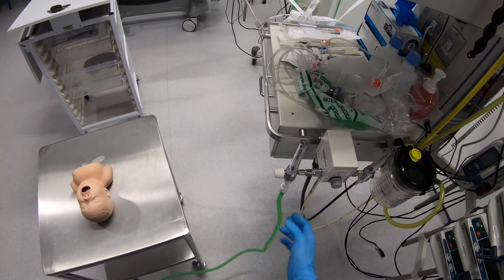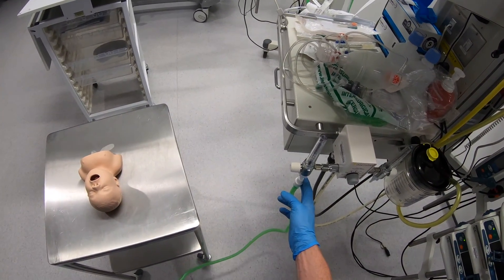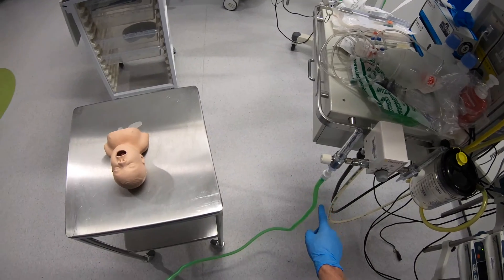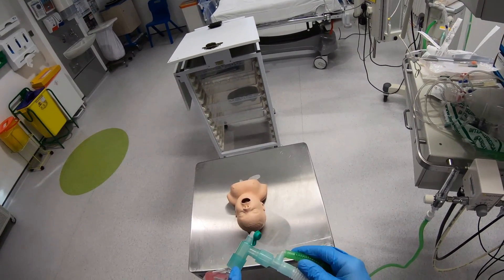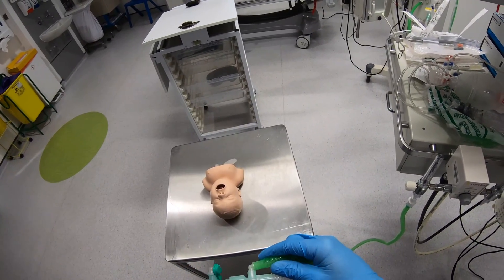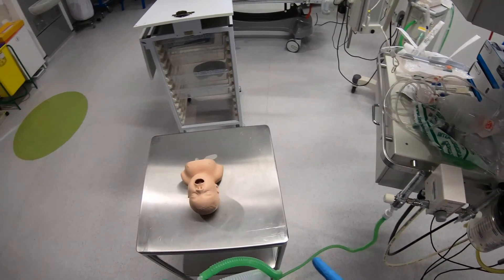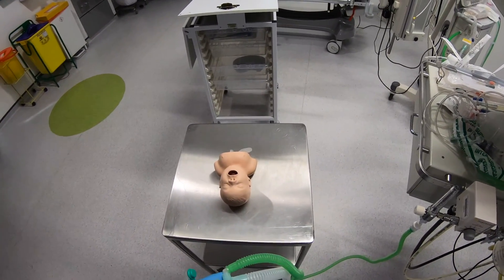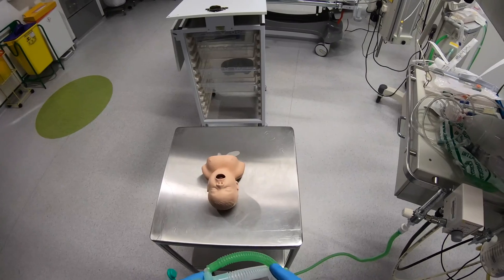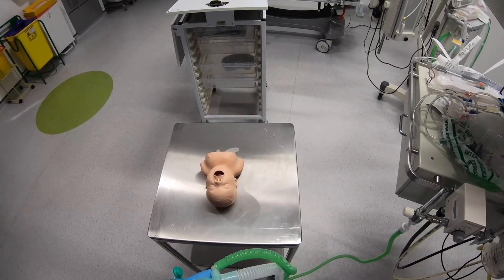You connect this end up to your fresh gas supply and oxygen then flows along down this tube and then is delivered to the patient through the face mask. Provided you've got the flow rate set high enough to meet the patient's demands, all the fresh gas — everything that the patient breathes in — comes from this fresh gas flow.